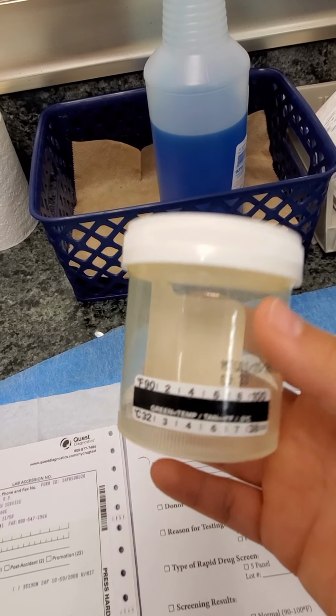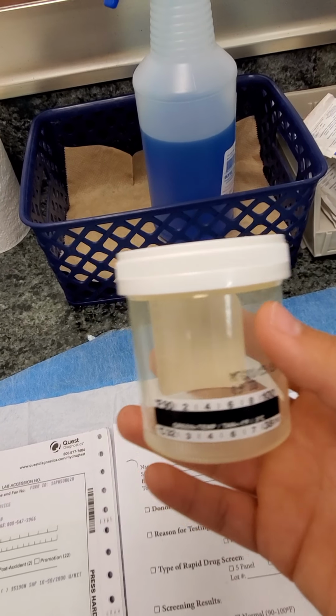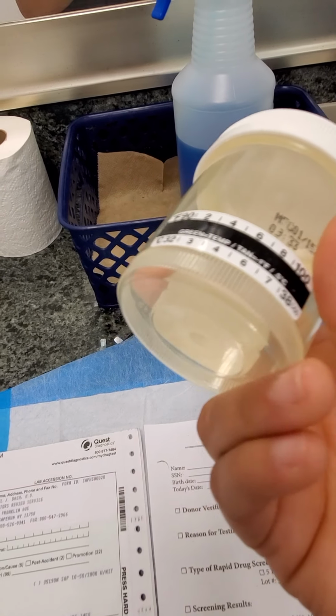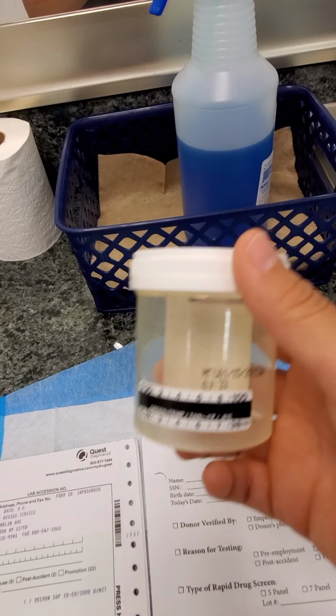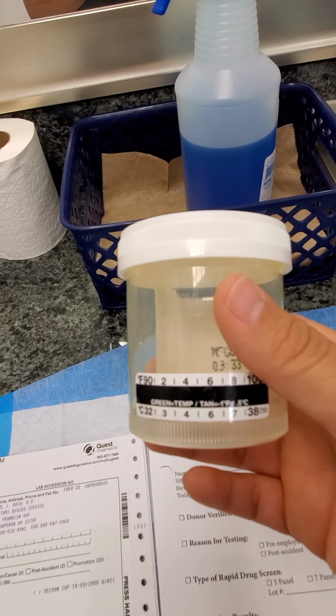You do not accept the specimen. At that point, you have to discard it. You have to let the patient know, I cannot accept this specimen because it seems to be oily, or there is some foreign body at the bottom, or it has a weird smell, chemical smell, bleach smell, whatever, and discard the specimen.